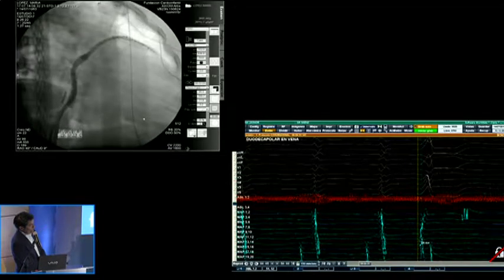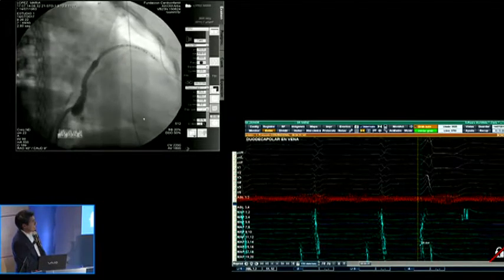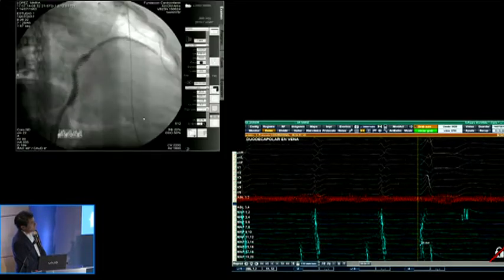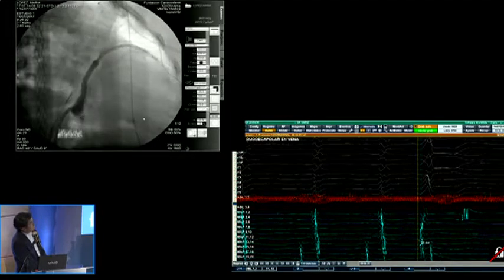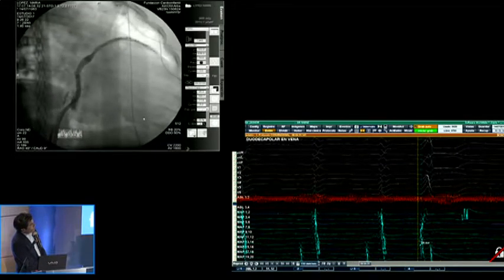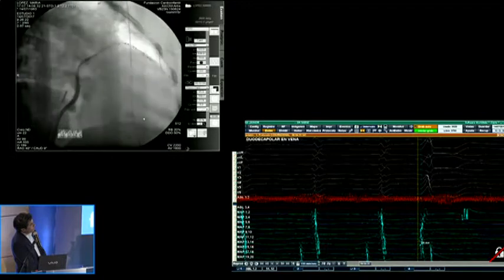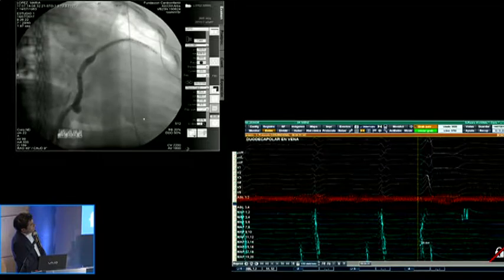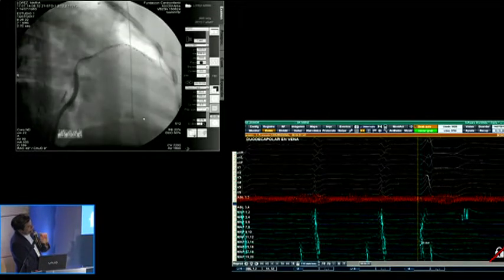So here you can see that in the 13-14 electrode, we have activation of 39 milliseconds pre-QRS. And that makes us think that the 13-14 lead is very close to the early activation of this extrasystole. That places you in the epicardic segment of the top of the left ventricle. It's not even the LV summit. The LV summit would be the 6th electrode. Here we are going down to number 7.